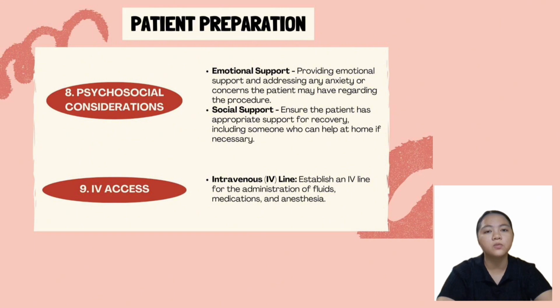At bukod dito, yung IV access, pwede rin siya maging safety measures dahil during the procedure, if ever magka-problema man or complication sa procedure, dito din naman pinapadaan yung mga emergency medications.